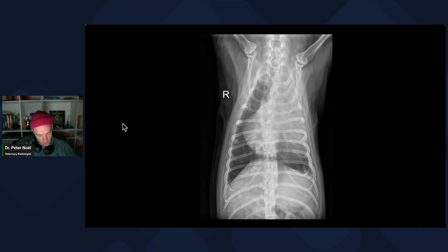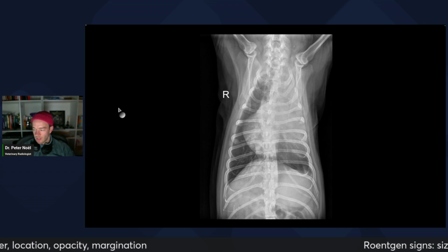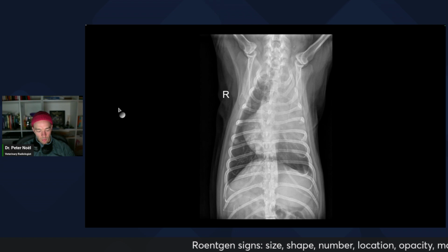Coughing, acute onset coughing. Okay, here we go. Anybody got anything? I'm going to turn these Röntgen signs off. These Röntgen signs are great. They really help when you don't know what in the world you're doing.